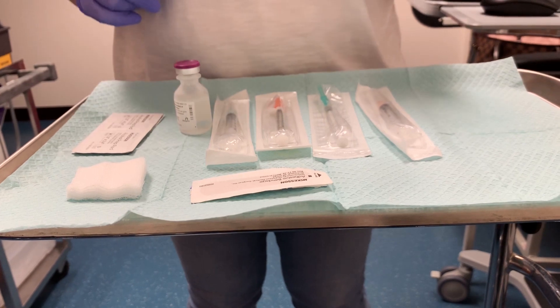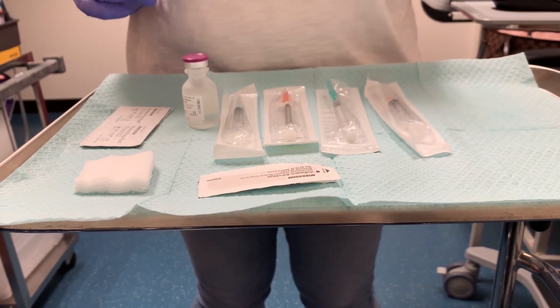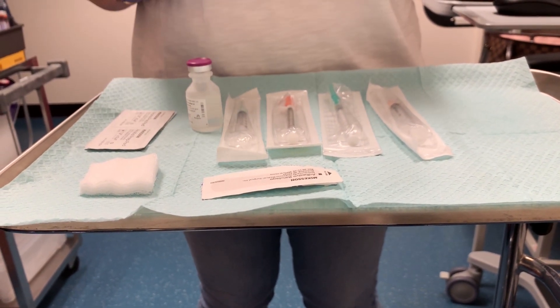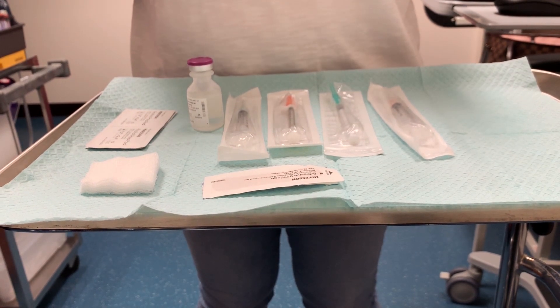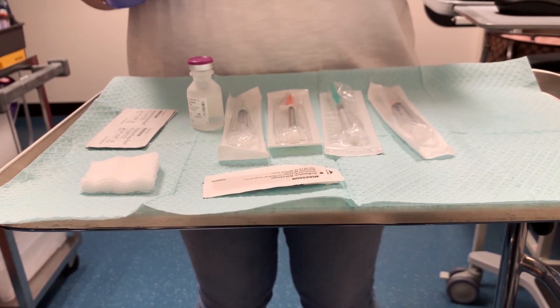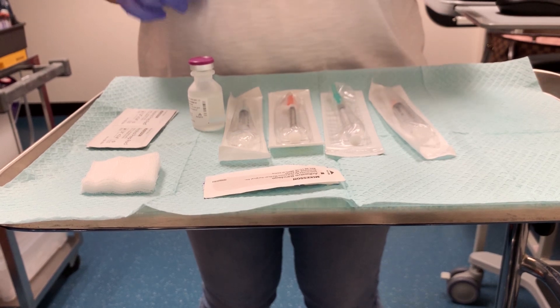Hey everyone, I'm going to show you how to do the withdrawal of medication from a vial and then how to do a subcutaneous injection. The first thing you want to do is make sure that you select the correct syringe and needle size for the vaccination that you are going to give.